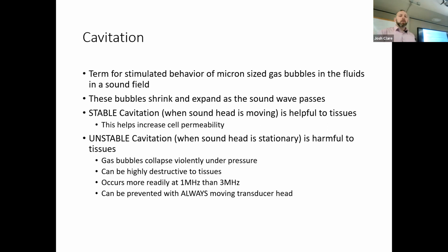The unstable cavitation, when we keep that sound head stationary, is harmful to tissues. The gas bubbles collapse violently under pressure. They can be destructive to tissues. It occurs more readily at the deeper settings, so we have to be even more careful when we're at the 1 megahertz setting. But as long as we're moving our sound head, we'll be safe. We're no problem with that. It's when we keep it still. Now, I will tell you the thing that's tricky.